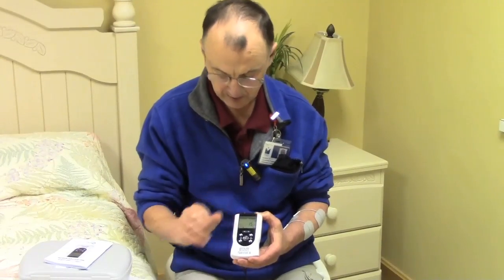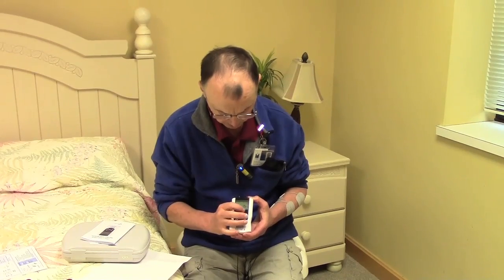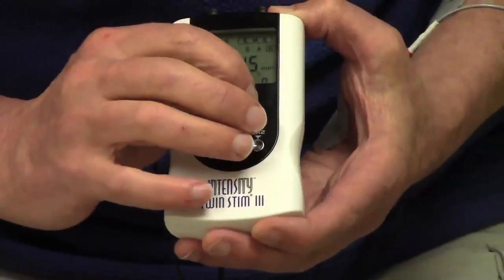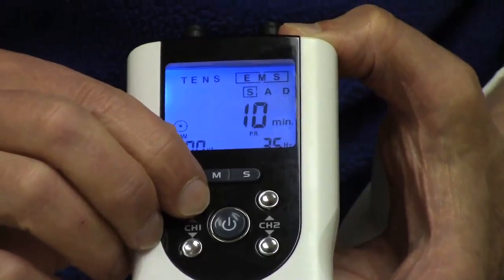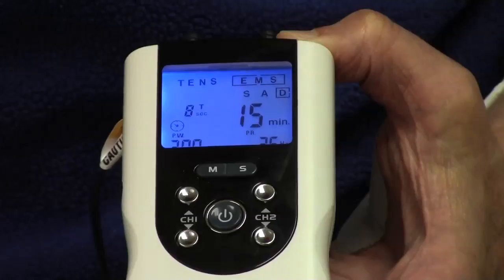If I had it on A mode, that would be alternating. So let's say I'm doing biceps and triceps — it would stimulate the biceps, rest, then stimulate the triceps, then rest. The one I'm going to show today is delay mode, D. In this mode it's going to be opening my hand and closing my hand in a pattern, which is fairly functional. To change modes you press the S button and use the silver buttons to move between S, A, and D. We're going to keep it on D mode.